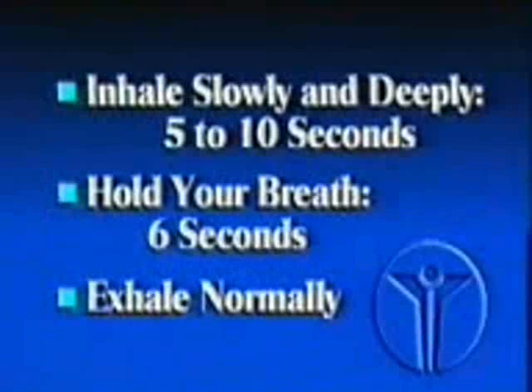After you have held your breath, relax and exhale normally. It is not necessary to force the air out or to make the exercises physically hard or tiring. A relaxed, easy pace is all that is required.